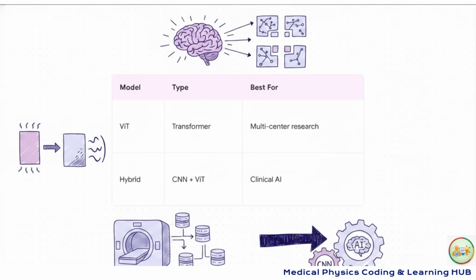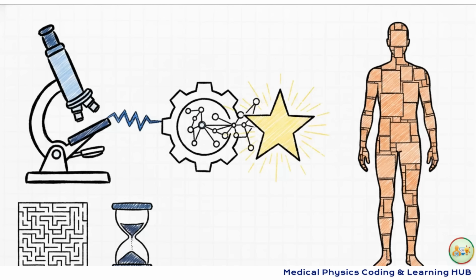And actually, this exact breakthrough paved the way for hybrid models, architectures that mash up CNNs and transformers. Taking an MRI input, these hybrids create the ultimate state-of-the-art synthetic CT output for future clinical AI systems. The synergy here is really what you need to understand. Vision transformers give us this incredible global context through patch embedding. Basically, the AI understands how the whole body fits together rather than just zooming in on a local edge. But they kind of fall flat if you don't have massive data sets.